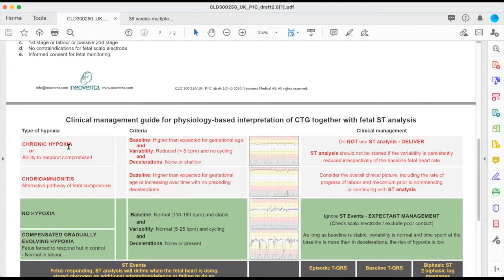But if I'm in the process of delivering her, I can't use Stan to monitor because this baby has already used up its resources. It can't give me more. Even if it has a tiny bit more of reserve, it might not be high enough to reach the threshold for Stan to start alarming. Does that make sense?